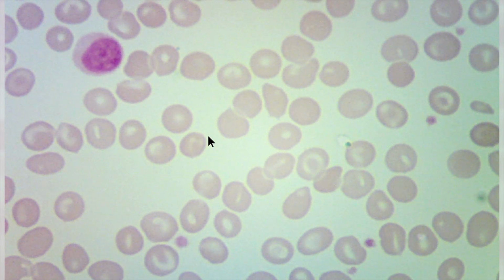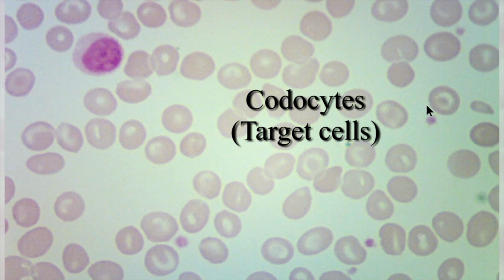Uniformly, they are going to have a smaller size than the nucleus of a resting lymphocyte, but this nucleus is not much larger than the resting lymphocyte. So there is microcytosis present on this smear. You always see target cells in hemoglobinopathies as well as in thalassemias. So target cells are also present in this smear.